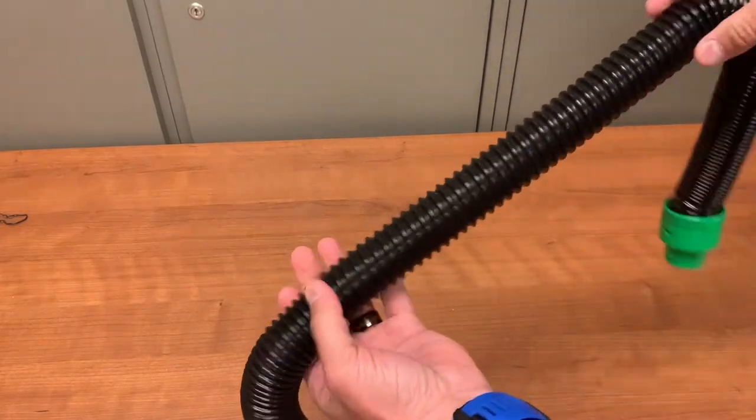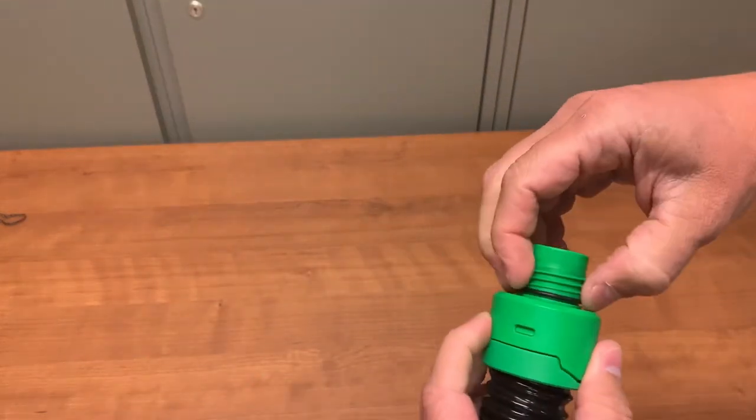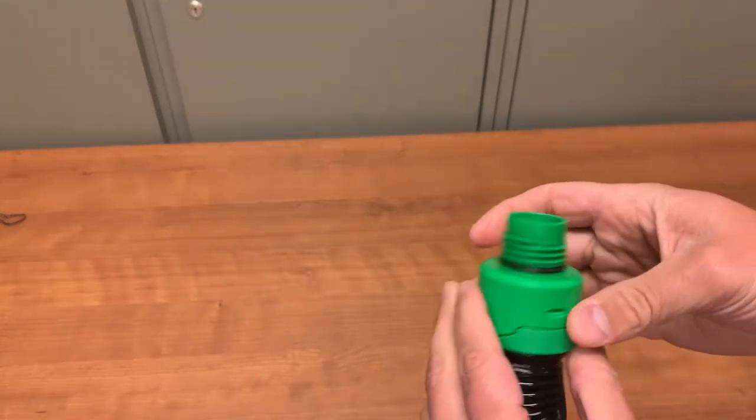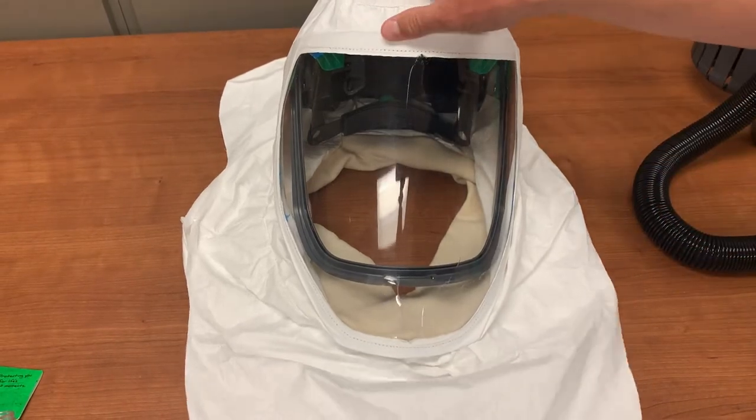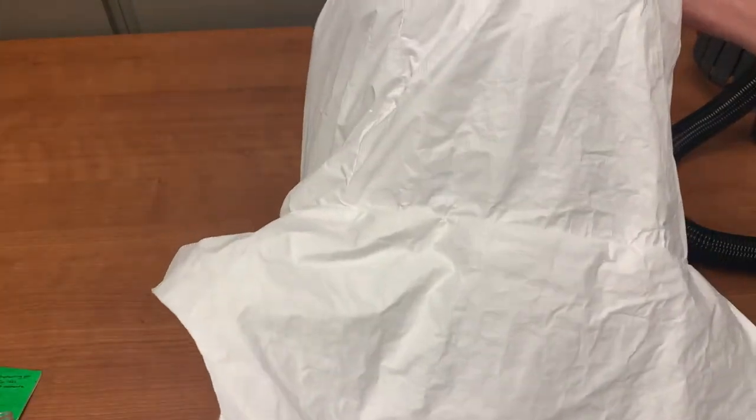Next, inspect the air hose. Look for any tears in the hose and make sure the rubber o-ring is in place at the threaded end. Inspect the hood for any tears in the material or cracks in the visor. If you find any issues with either the hose or the hood, do not use them.